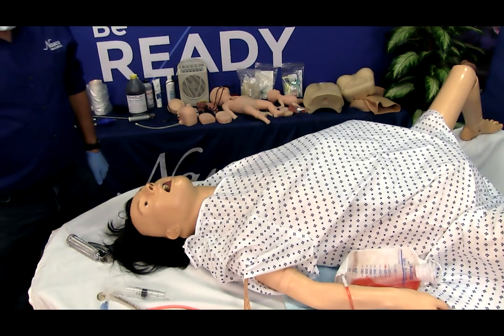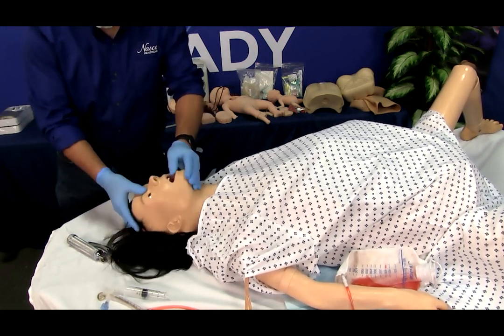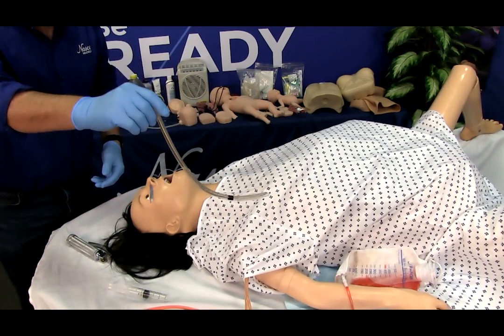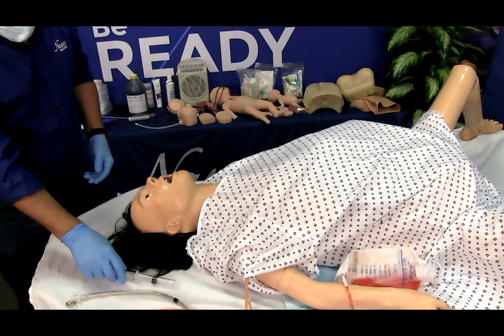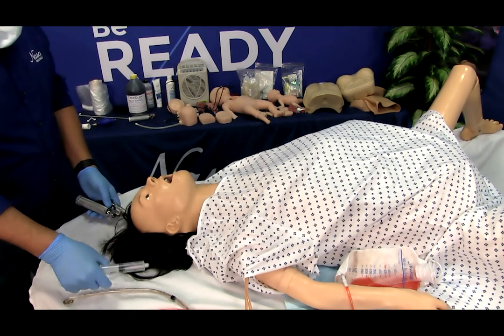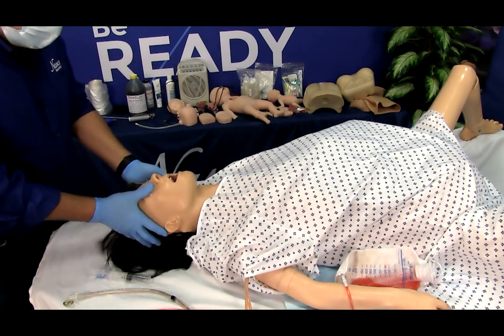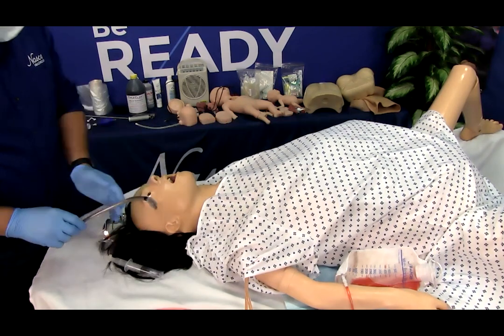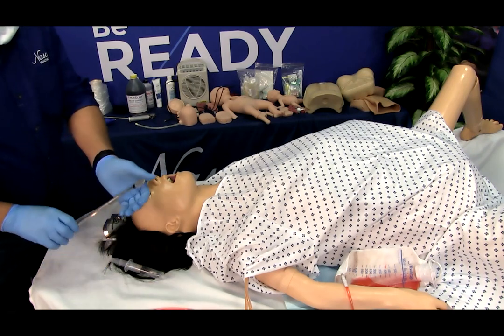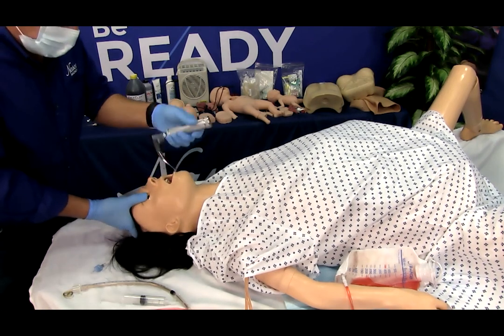All versions of Lucy have an airway that will allow intubation. Nasco Healthcare recommends the use of a 7.5 to 8 millimeter endotracheal tube for oral intubation and 7.5 millimeter or smaller for nasal intubation. Determine the method of intubation and select the appropriate size intubation appliance. Generously lubricate the airway and appliance. Intubate the mannequin.